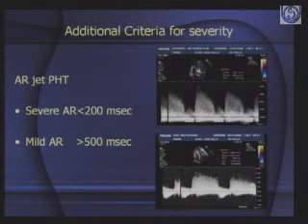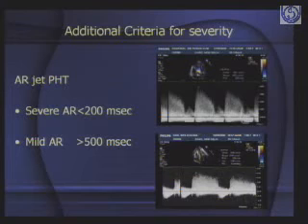The proviso here, the understanding here is very clear, that there shouldn't be any mitral valve disease associated, right? And there should be no severe aortic stenosis. So it should be free aortic regurgitation, and then pressure half time. If it is less than 200, it shows it is severe AR. So there are many patients who have isolated aortic valve disease in which pressure half time will help you. But the concept of pressure half time, as you know, was started with mitral valve area.